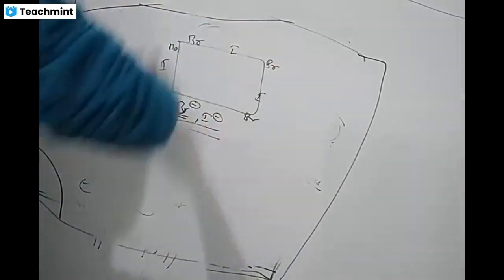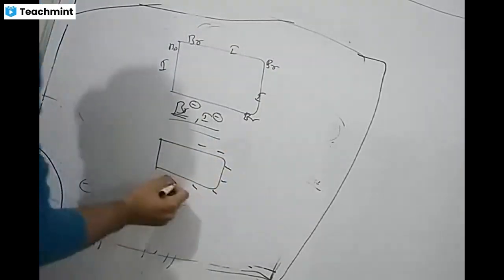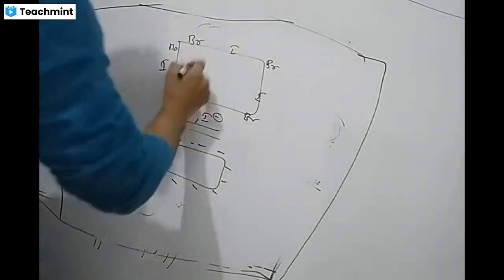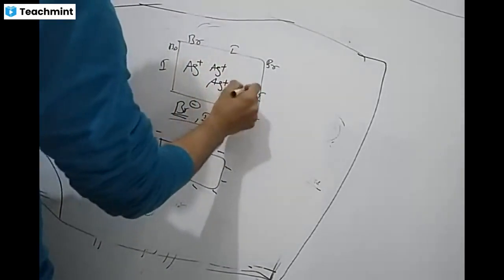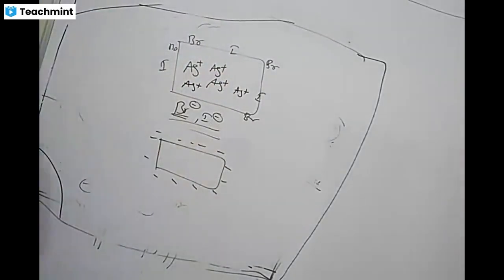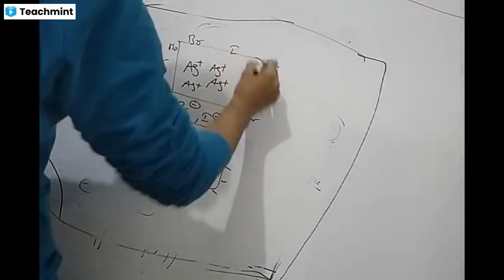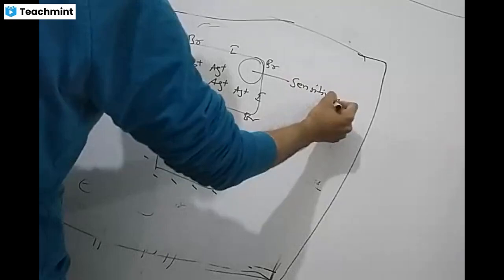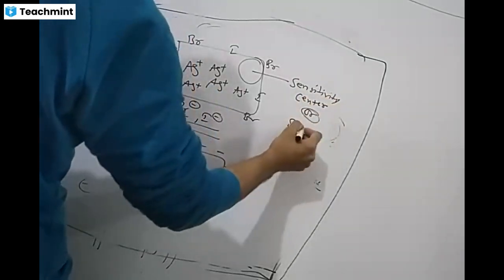It means that because of these halide ions, the whole surface of the crystal looks negative, and the interstitial ions are inside. Along with this, in this structure there is one spot called the sensitivity center, or sensitivity speck.